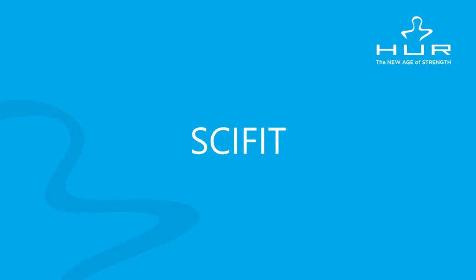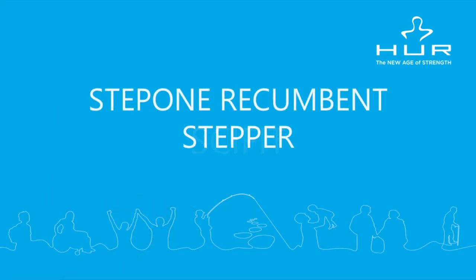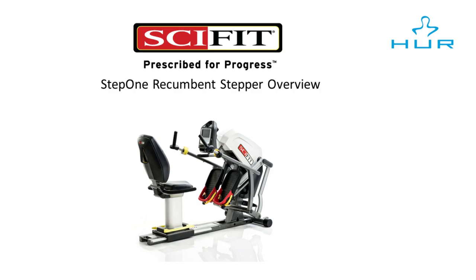Hello everyone. Welcome to the SciFit Step 1 Recumbent Stepper training session. In this session, we'll be looking at Step 1's various applications regarding who should use it and why, as well as its key features.